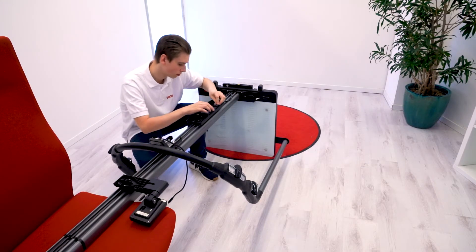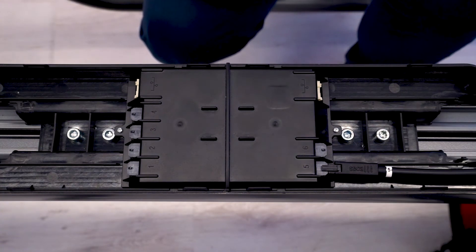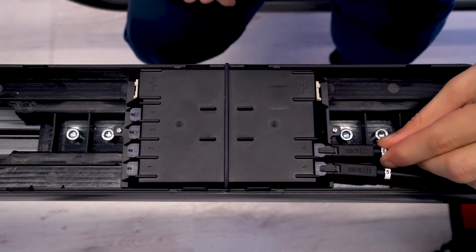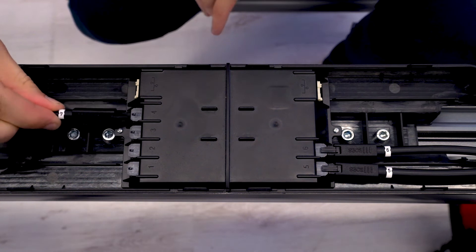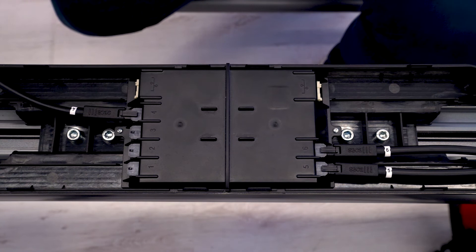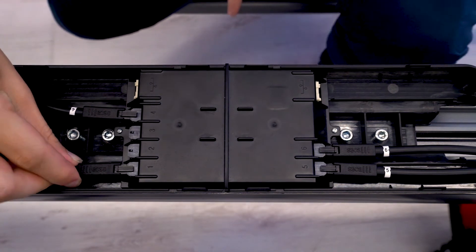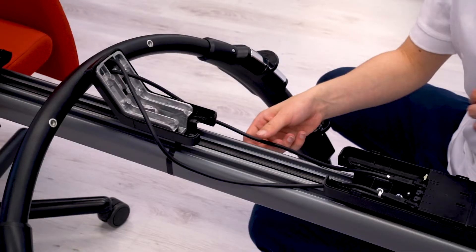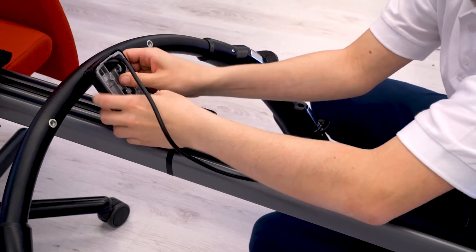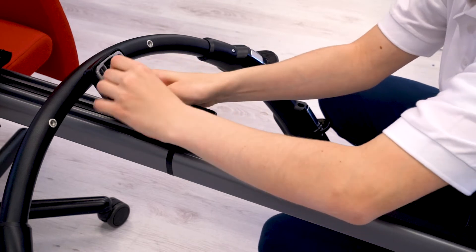Connect the cable originating in the platform and labeled 5 to socket 5 in the BIA box. Connect cable 6 from the platform with socket 6 in the BIA box. Connect cable 4 from the handrail to socket 4 in the BIA box. Connect the cable from the handrail labeled 1 into socket 1 in the BIA box. Route the cable away from the BIA box so that no tension is applied to the connector on the BIA box. Carefully stow excess cable in the handrail.